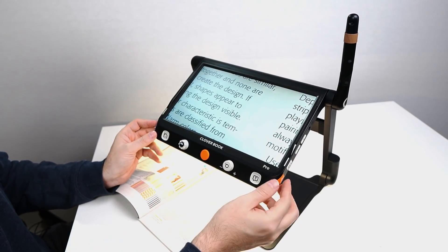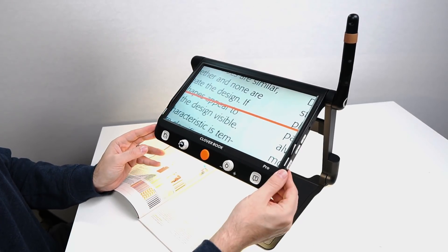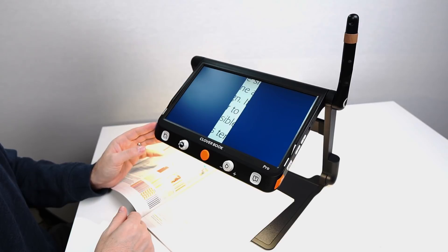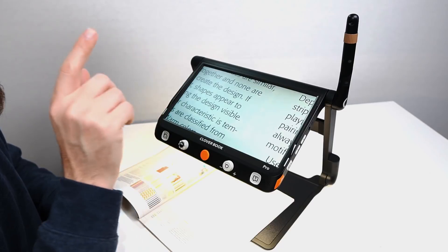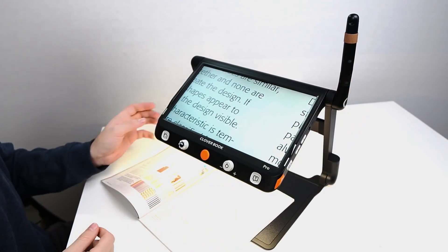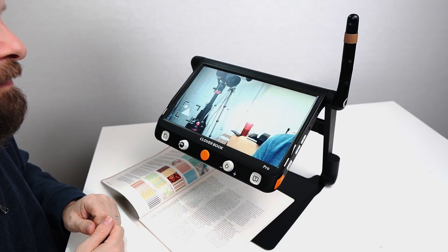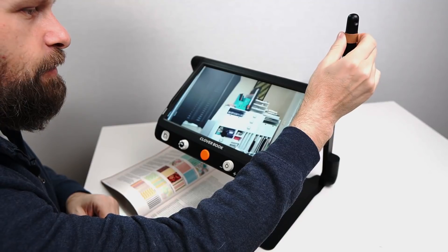This also has reading lines and masks. If I tap the line button on the left side, we have several options to choose from: a vertical line, shades, and horizontal and vertical options as well.